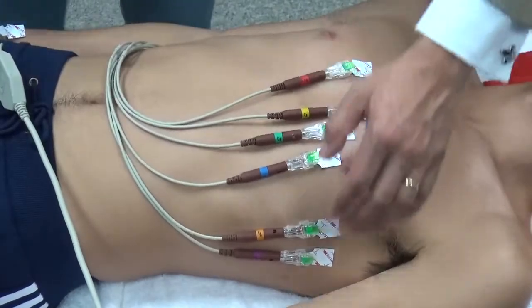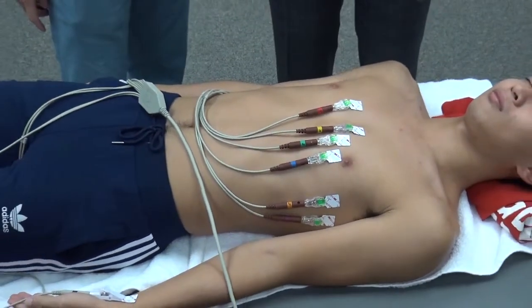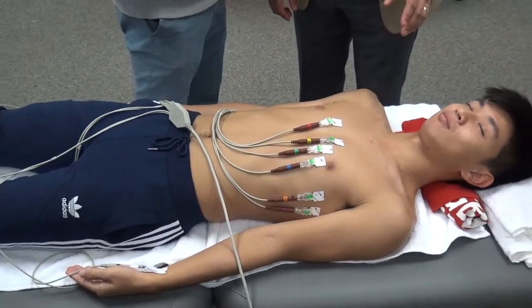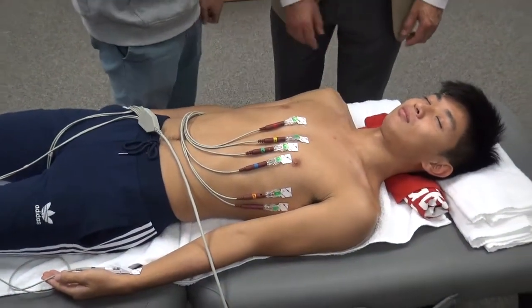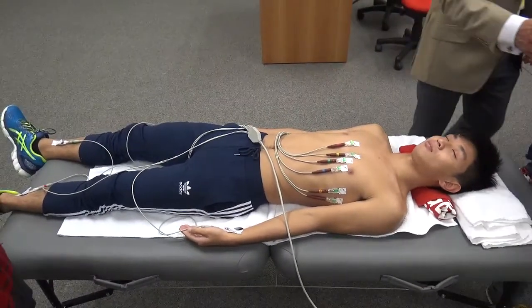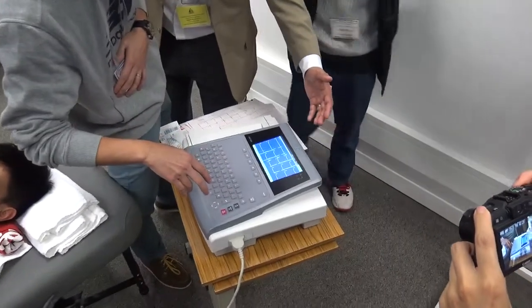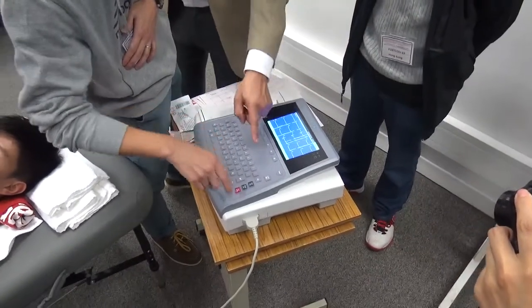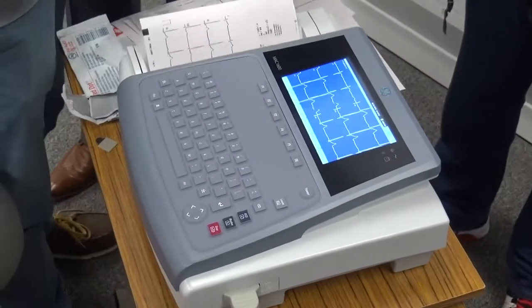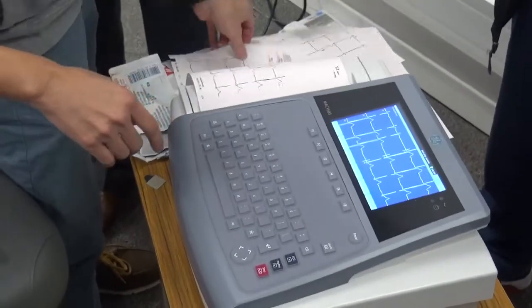Good. Now bring your arms back in, and now that's perfect. Now you say to him to relax. Ask him to relax his shoulders. Fang song in Chinese. Okay? Alright? Got that. Now you go over to look at your ECG now. You want to at least have one screen, if not two screens. Make sure it's nice and flat. There, it's great, isn't it? Yeah? So once you've got one or two screens, you then hit the ECG. And that's the best one today. Yeah. Okay, now you've got that.